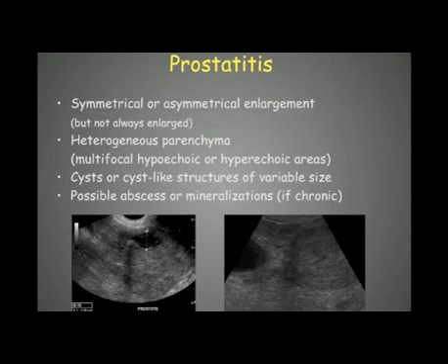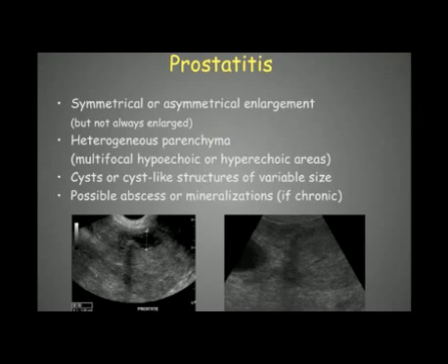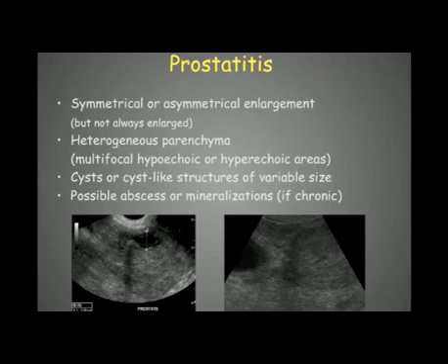On ultrasound, prostatitis will show enlargement, which can be symmetrical or asymmetrical, though sometimes the prostate is not enlarged but simply heterogeneous. The parenchyma will become heterogeneous with hypoechoic areas. Mostly we look for large cysts or cyst-like structures of variable size — those greater than one centimeter are suspicious and should be aspirated to determine if they are infected.